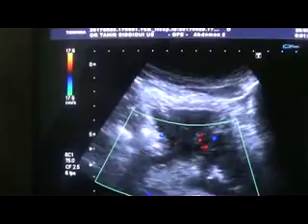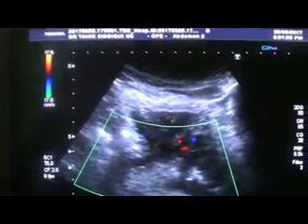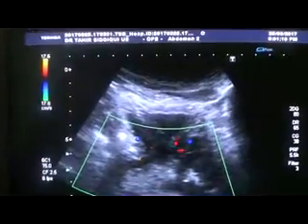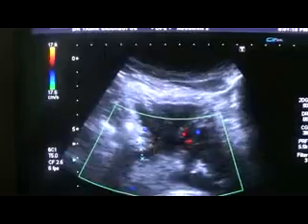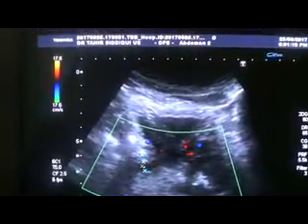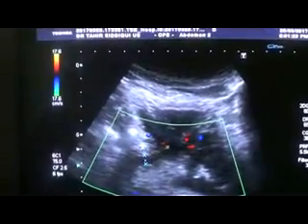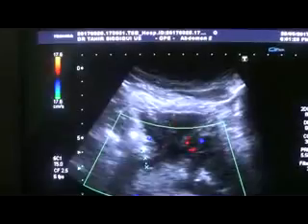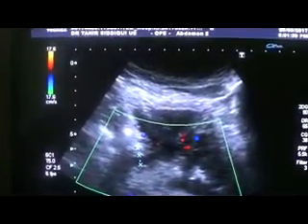This is the longitudinal section, prostatic mass, urinary bladder. Here you see the dilated distal ureter. It is entering up to this area, it's patent, but from here onwards, measuring 6.4 mm, it's not pouring out urine into the urinary bladder. So this is our case of the day. Thank you very much.